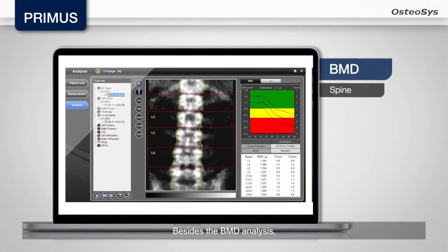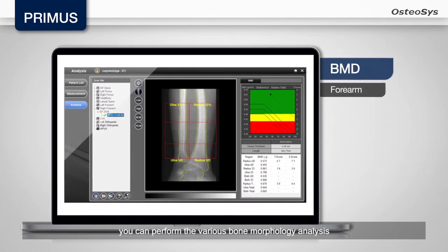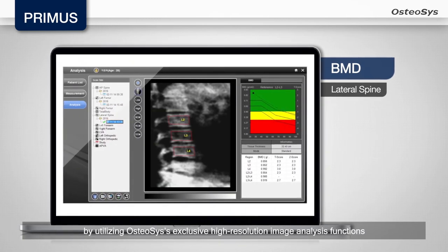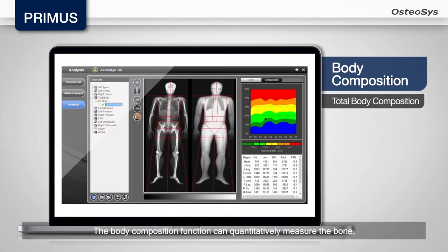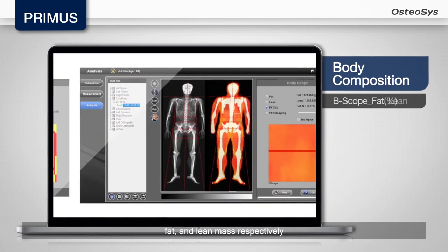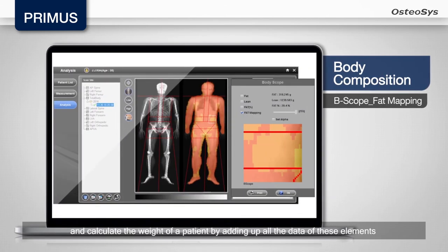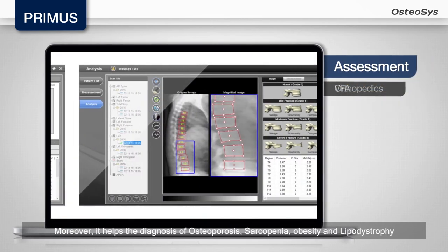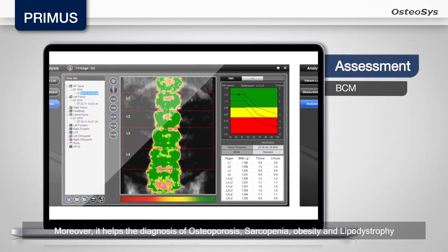Besides BMD analysis, you can perform various bone morphology analyses by utilizing Osteosis' exclusive high-resolution image analysis functions. The body composition function can quantitatively measure bone, fat, and lean mass respectively, and calculate the weight of a patient by adding up all the data from these elements. Moreover, it aids in the diagnosis of Osteoporosis, Sarcopenia, Obesity, and Lipodystrophy.